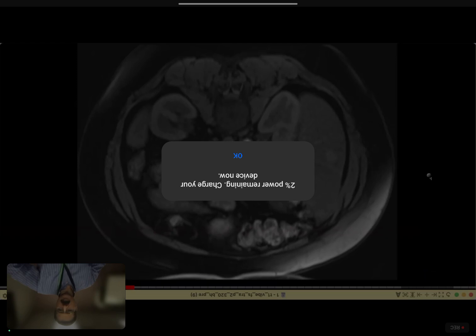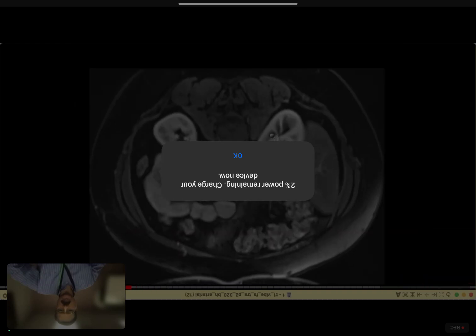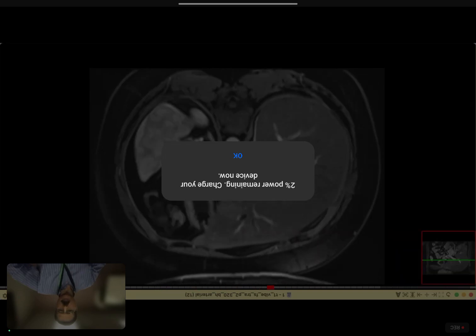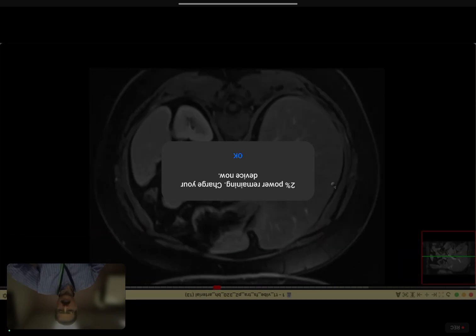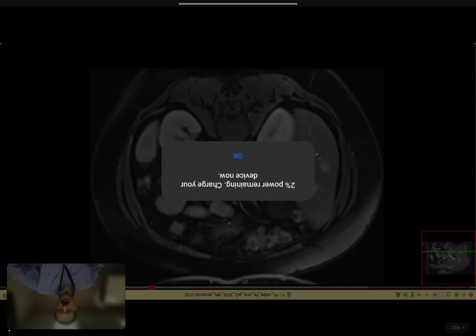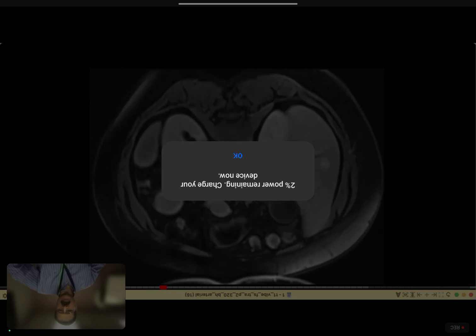And then we have got arterial phase, and on arterial phase, if you see, look at the cortex and the medulla, there is differentiation between the two, and the lesion enhances. Though there is blood in the portal vein, so this is what we call a late arterial phase. And then we have got a venous phase. Look at the cortex and medulla of the kidney, and you will appreciate that they have become of similar intensity. Now look at this thing is retaining contrast, and we have got more delayed. We have got 3-minute delay, then 5-minute delay, and 10-minute delay.